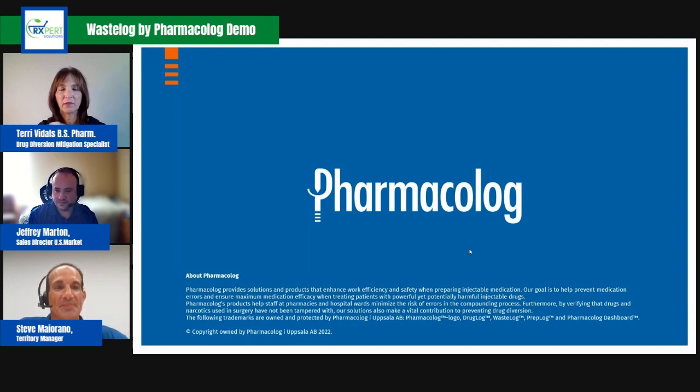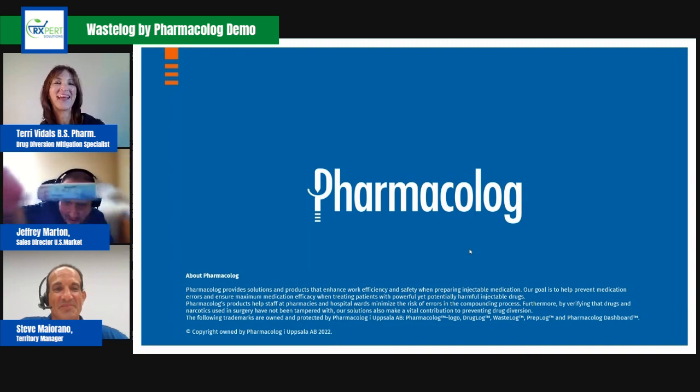I should have had a pen and paper to write down my questions, but some you answered with your summary. So you had mentioned it can scan the barcode. You're talking about the drug itself from the manufacturer, but then you also mentioned Codonics, which I'm thinking they have a barcode too, right? They do. Yes. I have a sample right here, and I don't know if you can see it or not. Well, there it is. It's a lined sample of just fentanyl, but it's not actually fentanyl. It's not exactly fentanyl, but there it is.